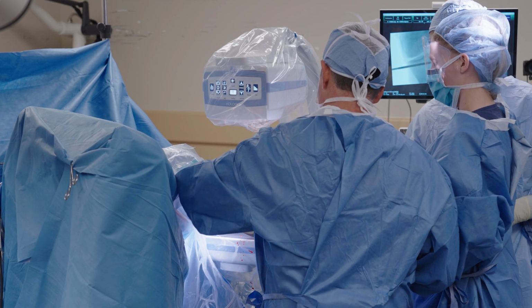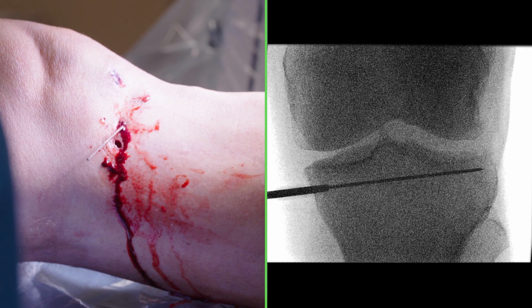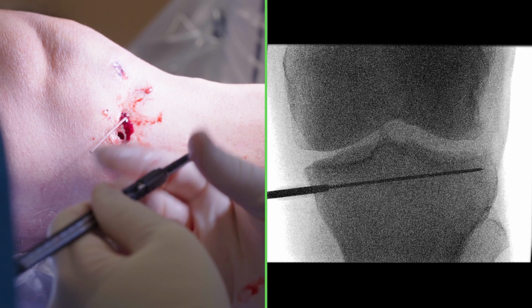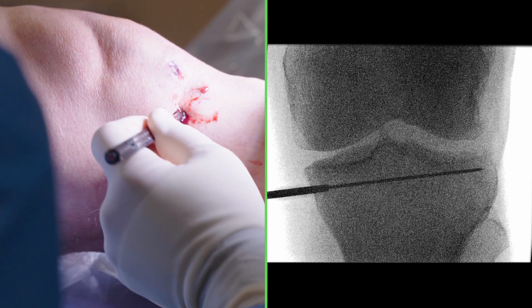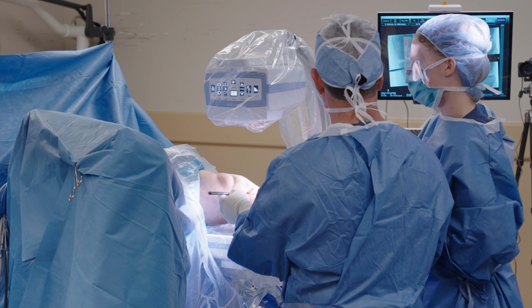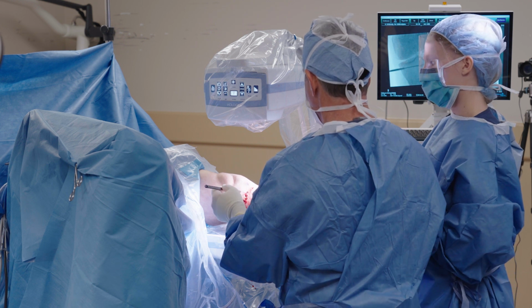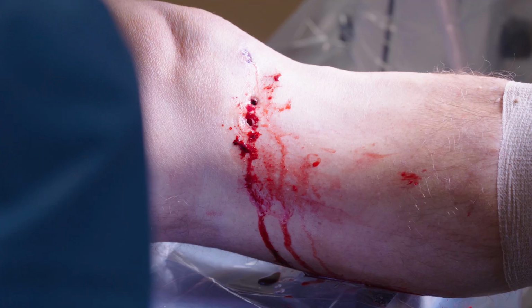Okay? Sometimes I can just do that by hand. We'll use the depth gauge one more time. So we'll use the indirect ruler now just to verify our depth. In this instance, we're measuring 63, but I'm going to verify that now with a traditional AO depth gauge.